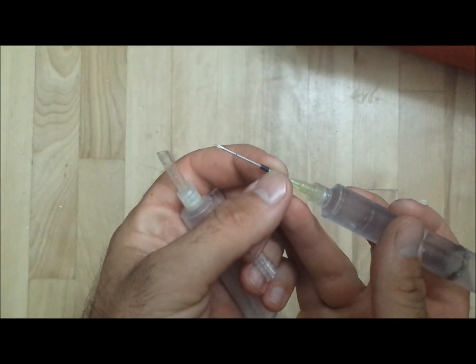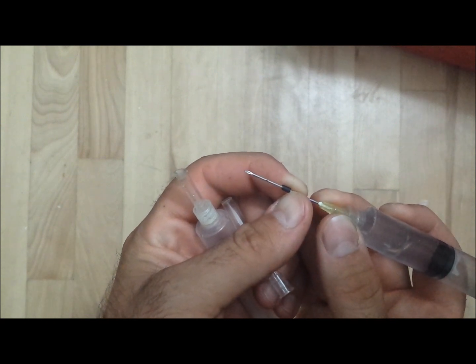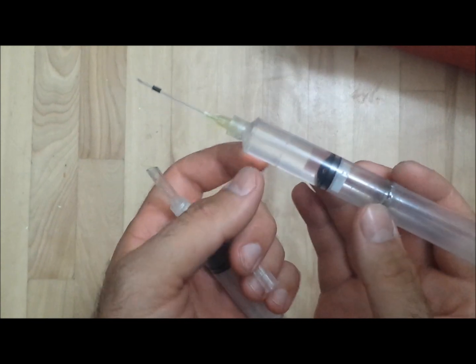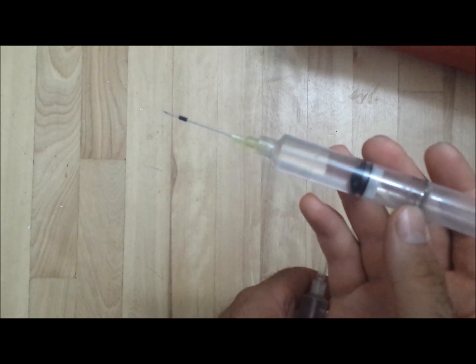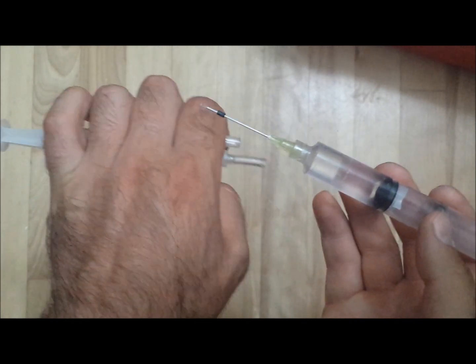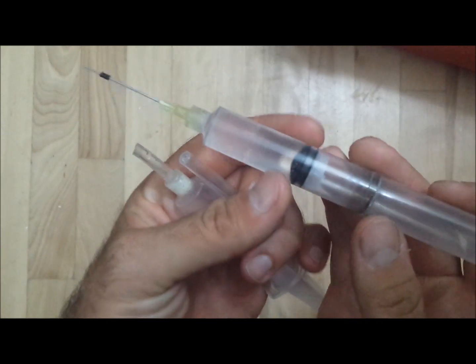Next you have to install this little rubber piece, and it has to go right over the hole like that — that's what keeps the pressure in. As you see, I've already preloaded it with some water, and that's easily done by taking the syringe, filling it up with water with a tube, removing the needle, and injecting it in there.